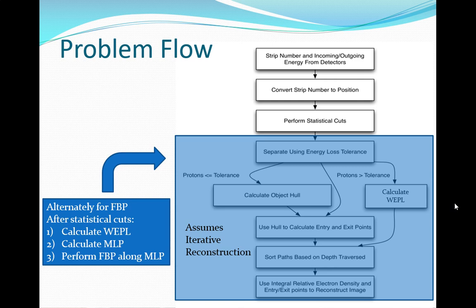From our local group, there are other groups that pre-calculate it. It's six of one, half a dozen of the other. I do think it is the right thing to do it at the last second, just in time. We calculate every single time. And the reason is we don't want to store it, because it takes a lot of memory, to be very honest with you. And it's pretty quick to calculate if you do it right.